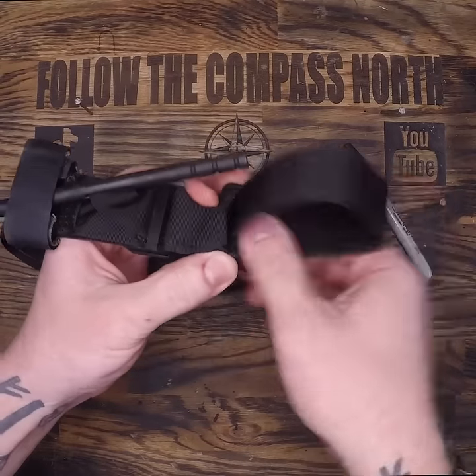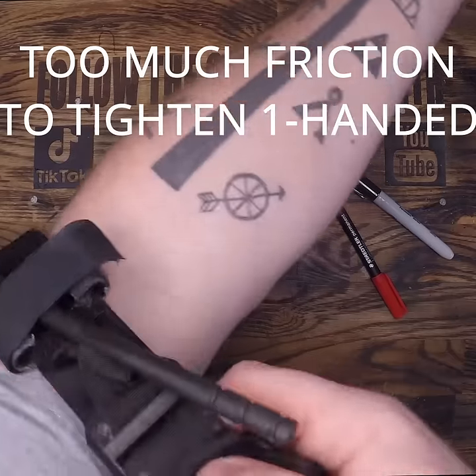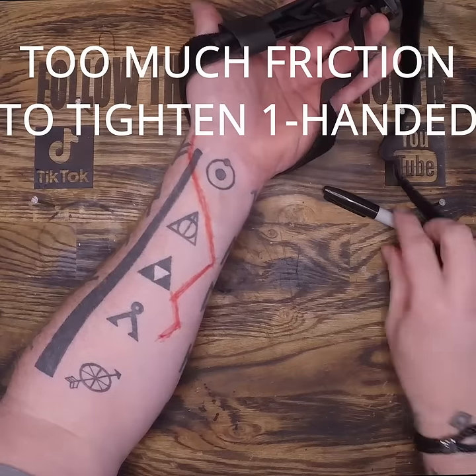I always pull the main strap out of this plastic clip, because it's almost impossible to apply this one-handed when it's running through both sides of that plastic retainer.